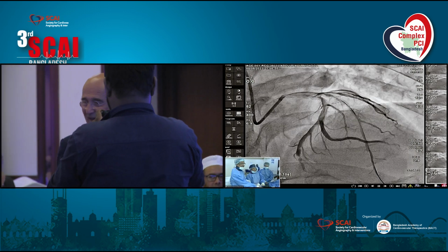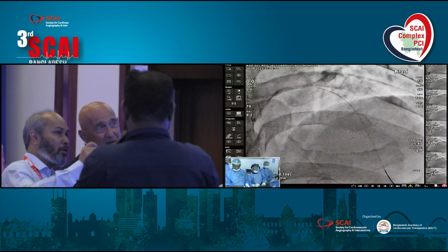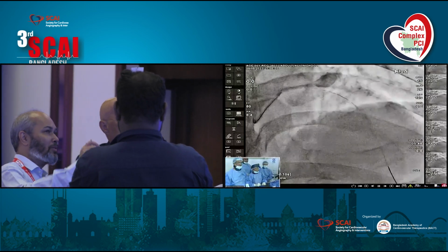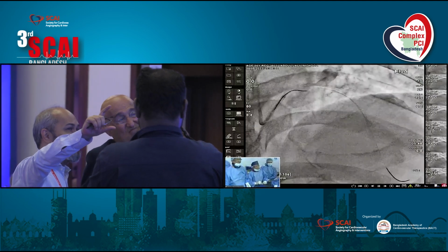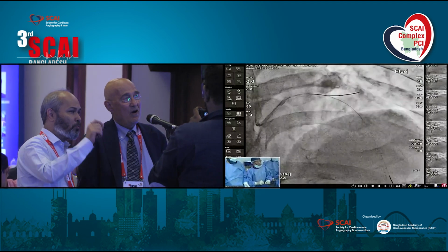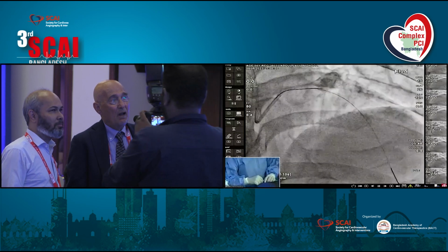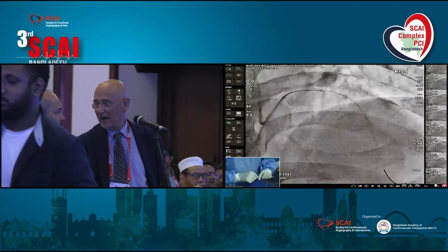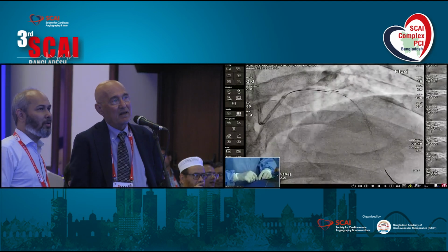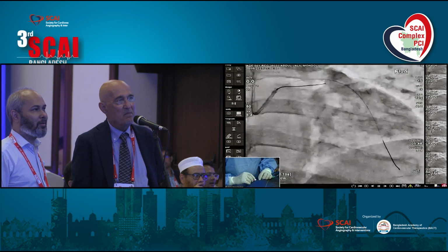So what's their problem? Their problem is, do you want to protect the diagonals? Because the diagonal seems to be a good caliber vessel, though not too important. But do you think we should protect this side branch? I think the lesion is distal to the diagonal, and I'll not protect. But anyway, putting a wire will not take that much time.